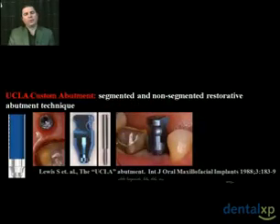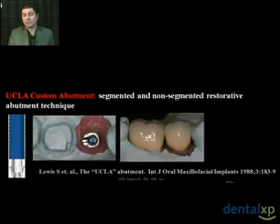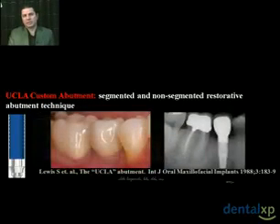Consequently, most anterior restorations and the abutments associated with these restorations, the abutment is generated with the custom technique, the UCLA technique. In this way, the dental ceramist can generate an abutment, develop an emergence profile subgingivally, so that as the crown is cemented, the margins are only placed slightly subgingival, with all of the emergence profile and the soft tissue being supported by the abutment itself and not by the restoration, providing ideal aesthetics, simplified procedures, and ultimately an excellent functional and cosmetic result.